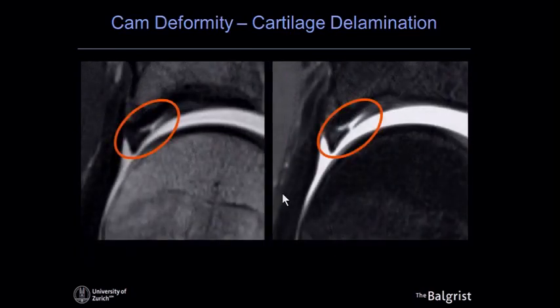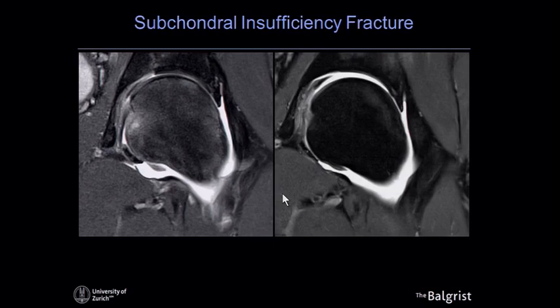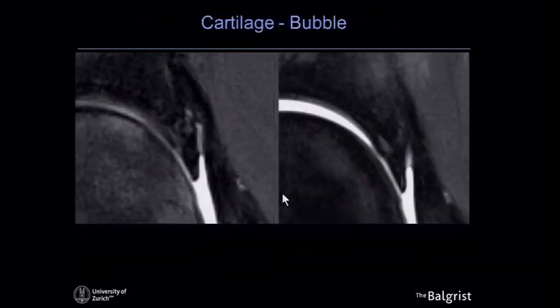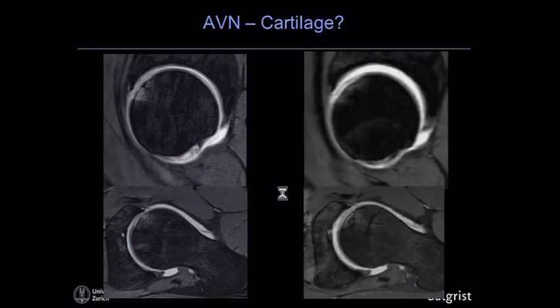Here is a patient with a small insufficiency fracture on the femoral side with bone marrow edema — the question is whether there is also a cartilage lesion. Correlating with the traction arthrography, you can indeed see a cartilage lesion, shown in a blown-up image as a bubble lesion where the cartilage slightly protrudes into the joint space. Dark cartilage on a proton density or T1-weighted image may be a sign of delamination. Another case with AVN: with traction, it becomes evident there is a large area of delamination in this segment of the femoral head.